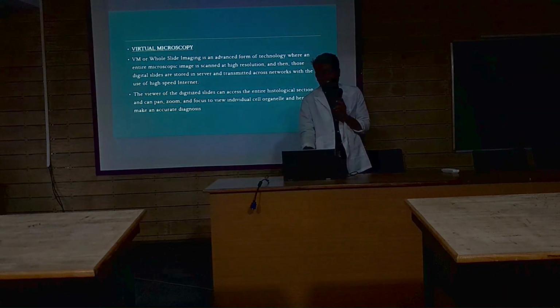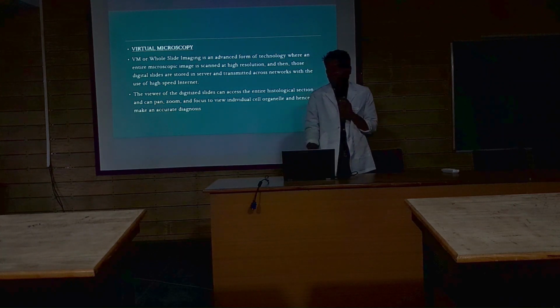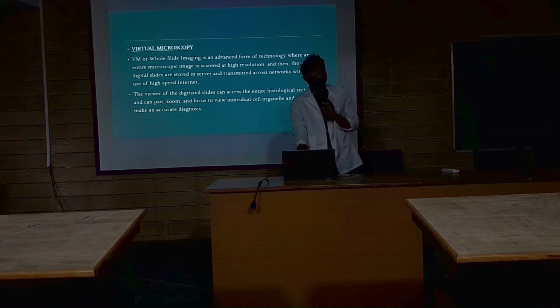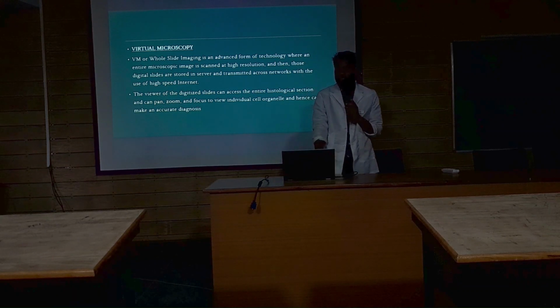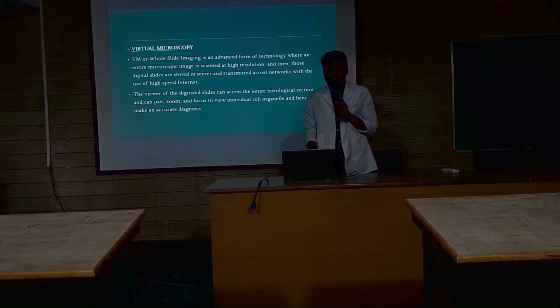Now we have virtual microscopy. Virtual microscopy, or whole slide imaging, is an advanced form of technology. Conventionally, we take a slide and view it through the microscope, so it takes a long time in diagnosis.